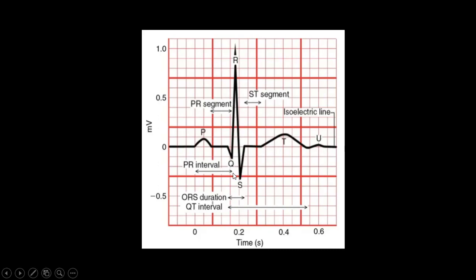I repeat, QRS complex is produced by the ventricular depolarization. Deepening of Q wave is an indicator of myocardial infarction. Tall R wave is seen in ventricular hypertrophy. The QRS complex is prolonged in bundle branch block, and the low voltage is usually observed in hypothyroidism and pericardial effusion.